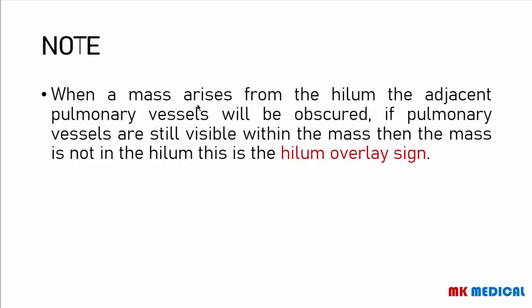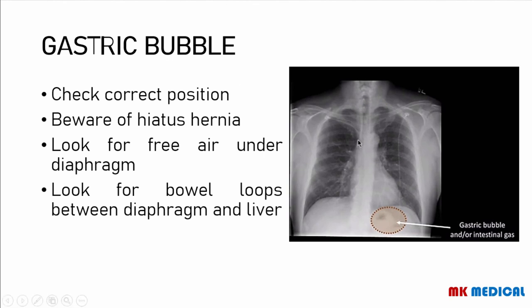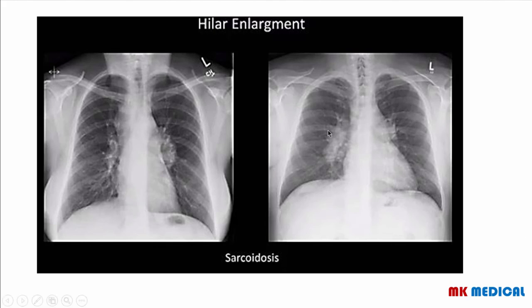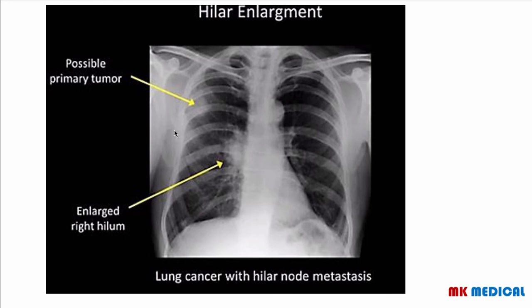Here is enlargement of the right hilum with a possible primary tumor — a person that had lung cancer with hilar node metastasis. When you have a mass arising from the hilum, this mass is going to obscure the adjacent pulmonary vessels. If the pulmonary vessels are still visible within the mass, then the mass is not in the hilum. As long as the mass is in the hilum, the pulmonary vessels will not be visible. You refer to this sign as the hilum overlay sign. On the normal X-ray you can see the vessels very well, but in a pathological process affecting the hilum you're not able to visualize any blood vessels there.